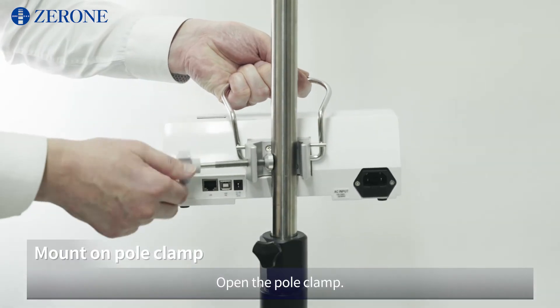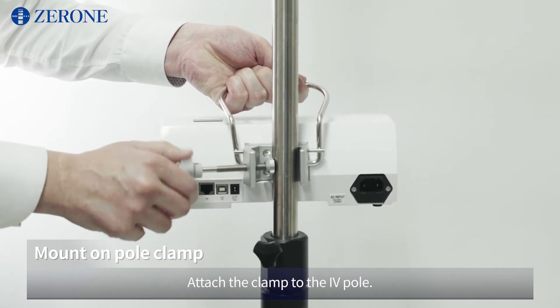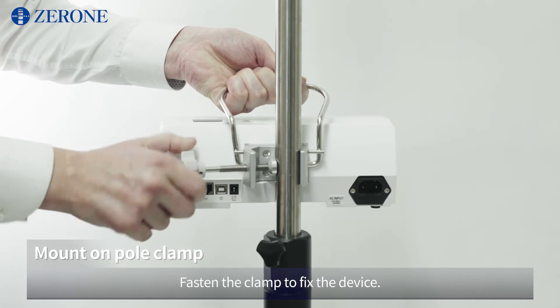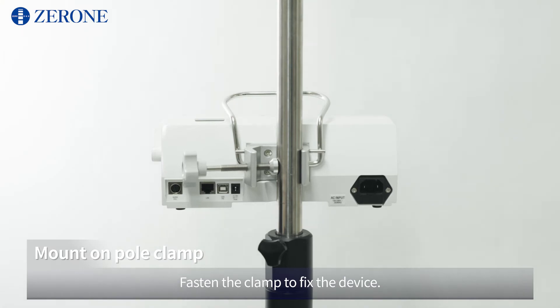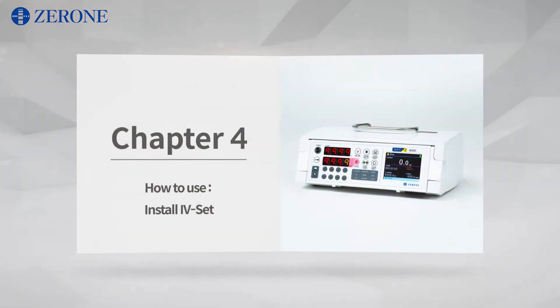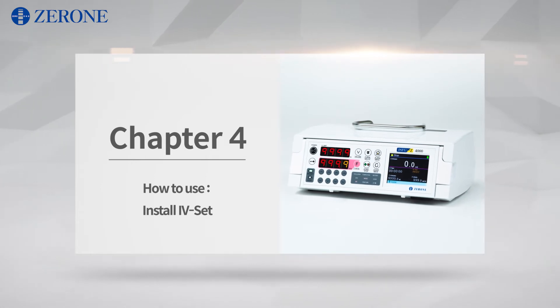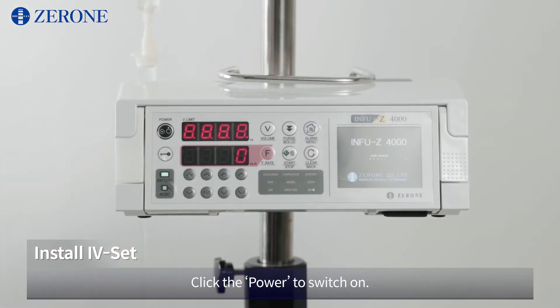Open the pole clamp and attach the clamp to the IV pole. Fasten the clamp to fix the device. Click the power to switch on.